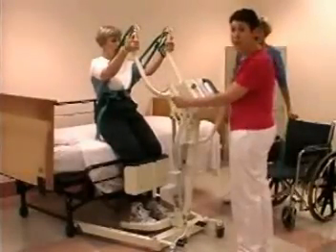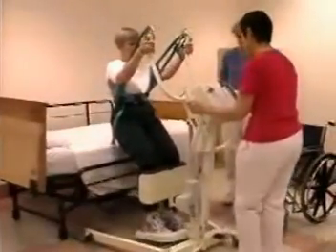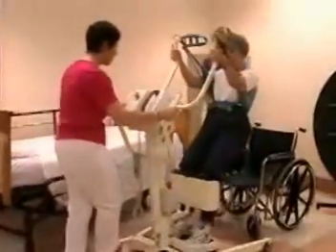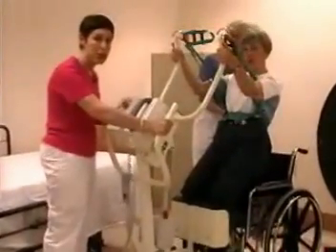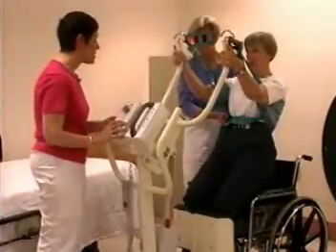She's cleared the surface, so now I'm going to move her over to the wheelchair. Okay, the second person makes sure that Mrs. Johnson is far enough back in the wheelchair, and when everything is set, I lower the arms.